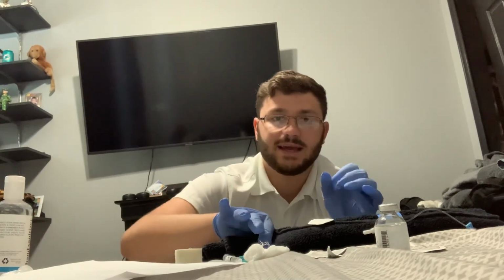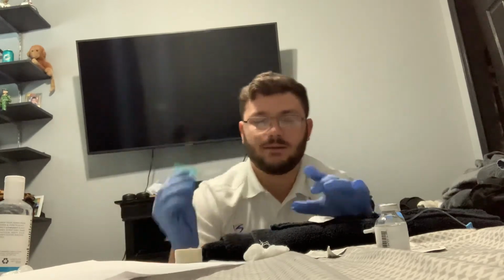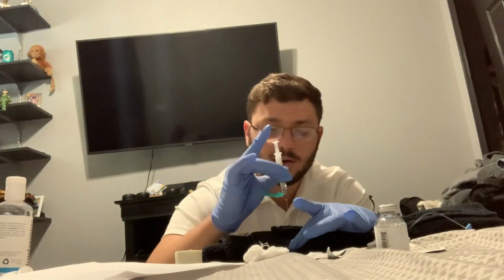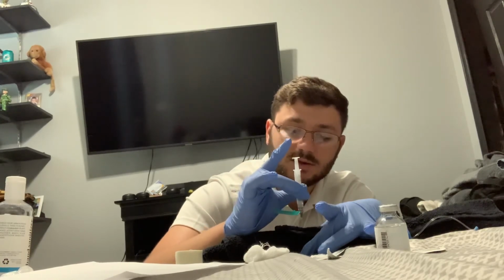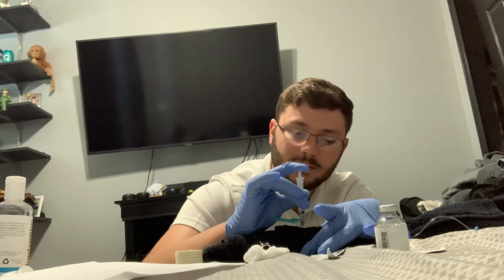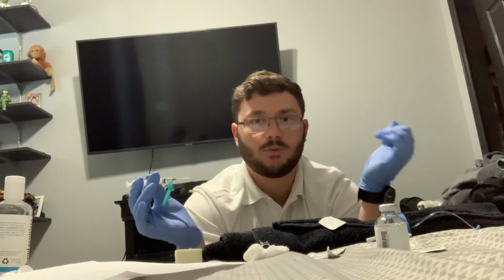So next, I'm going to be using the Z method, and I'm going to pull the skin as much as I can to create as little resistance as I can. So I have that pulled. Well, I'll once again use the rainbow method to take off the syringe cap. I'm going to pull and go in at a 90-degree angle. I'm ensuring that I'm not pinching, I am pulling, and I'm going to inject in up to 5 seconds, slowly. So that has been removed. So now I'm going to let go, and the skin should close, allowing the muscle to almost seal.